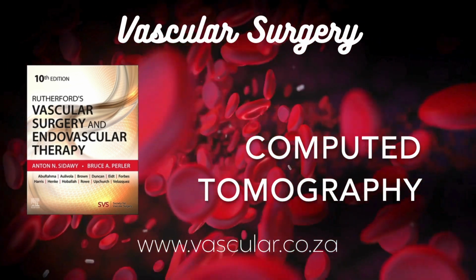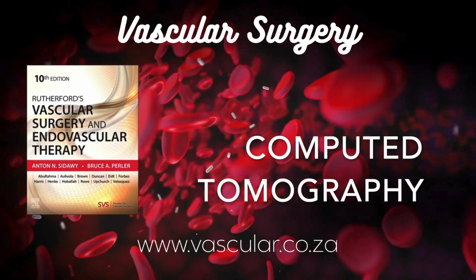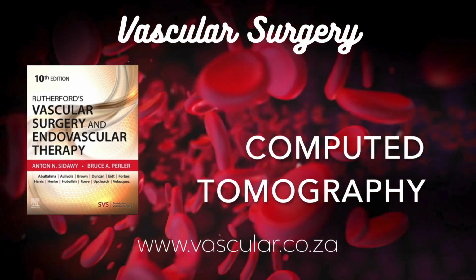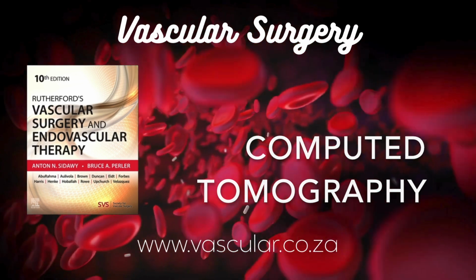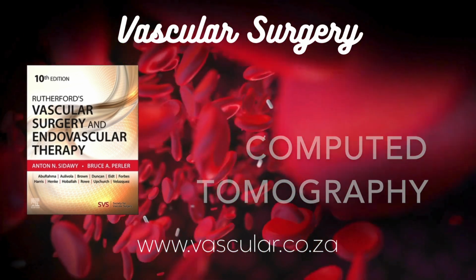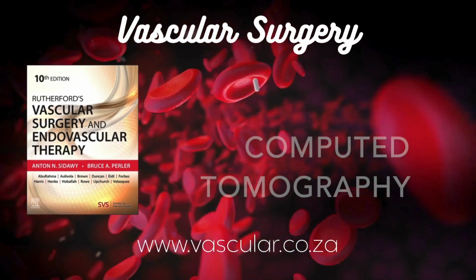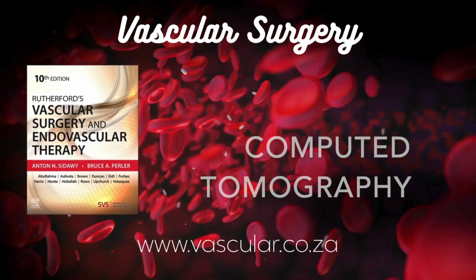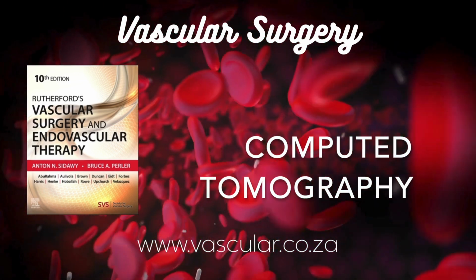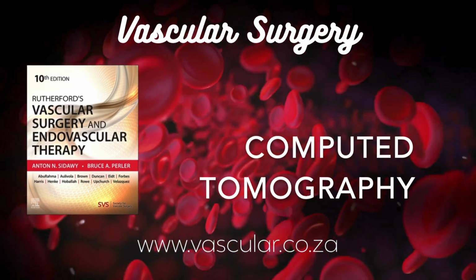So a narrow window. A narrow WW, say 400 HU, is good for looking at soft tissues where the densities are all quite similar. It exaggerates small differences in HU values, enhancing contrast between, say, muscle and fat. And a wide window. A wide WW, maybe 1500 HU or more, is used when you need to see structures with very different densities simultaneously, like the lungs, mostly air, low HU, and the ribs, bone, high HU. It compresses the grayscale, so you lose subtle soft tissue contrast, but you can see the extremes without anything being pure white or pure black. Makes sense. You adjust the window to see what you need to see.